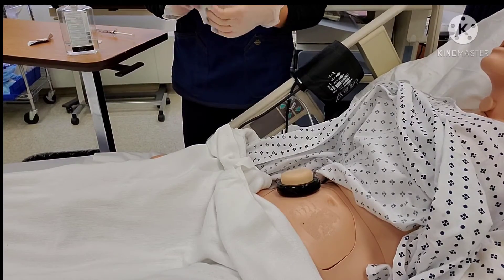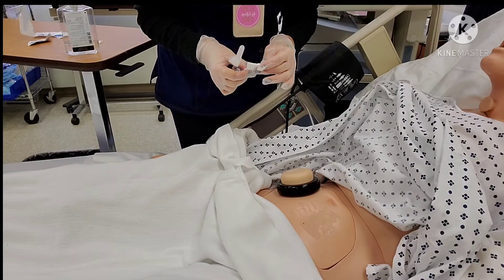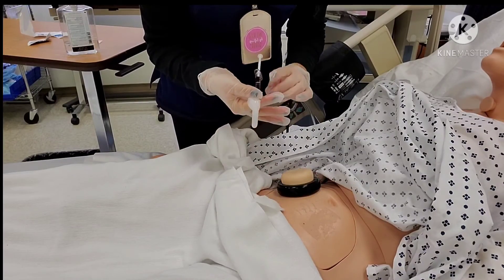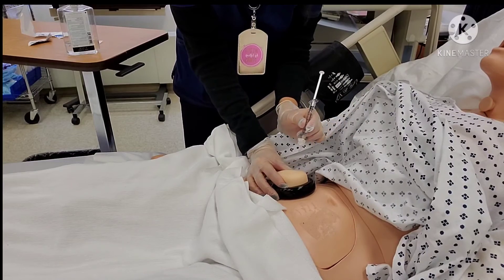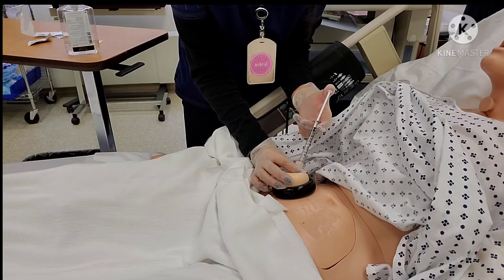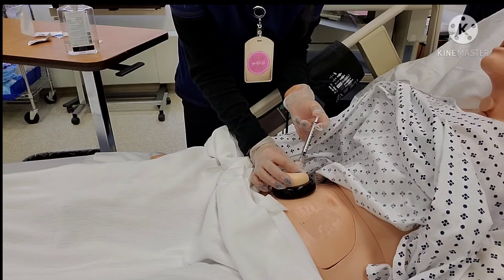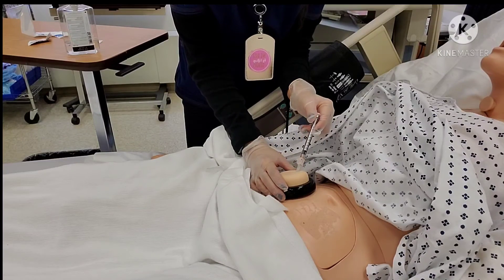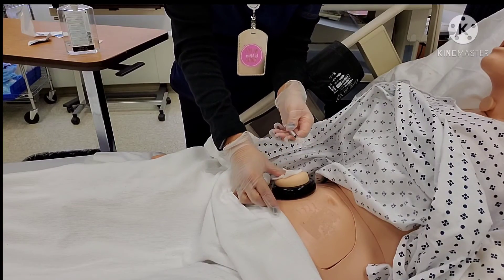As a nurse, you're always assessing your patient — look at the abdomen. If you notice bleeding, bruising, or anything that shouldn't be there, try to use a different site or another side of the abdomen. I'm going to remove my cap, pinch the skin of the abdomen, and go 45 to 90 degrees. I'll dart the needle, secure my syringe, and administer the medication at 10 seconds per milliliter. I have one milliliter, so 10 seconds. Then I'll hold it for a count of 10, remove my hands, withdraw my syringe, activate my safety, and apply firm pressure. That goes right into my sharps container.